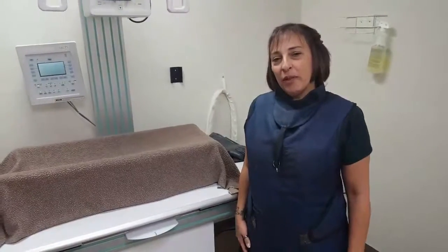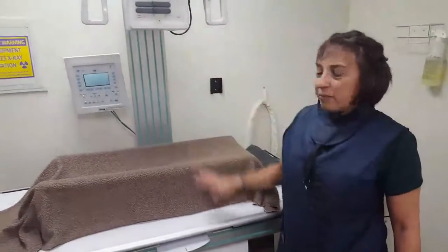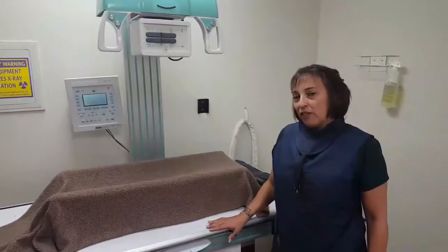We're here to perform radiographs on one of our dogs, or one of our patients. This is our radiograph machine. We are the digital machine. We are performing this to check for hip dysplasia.